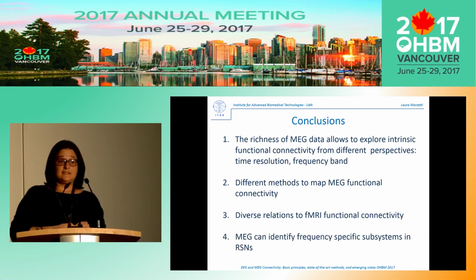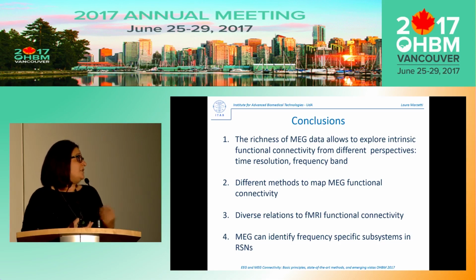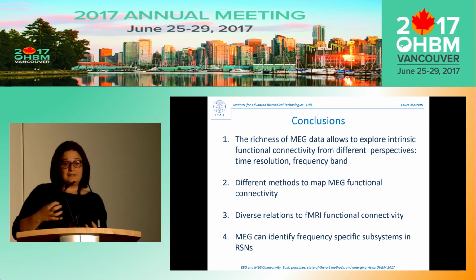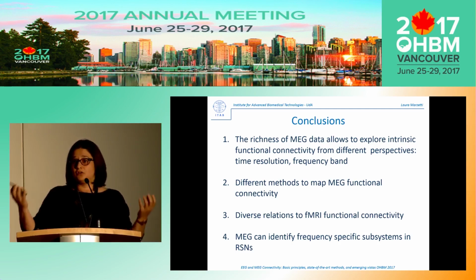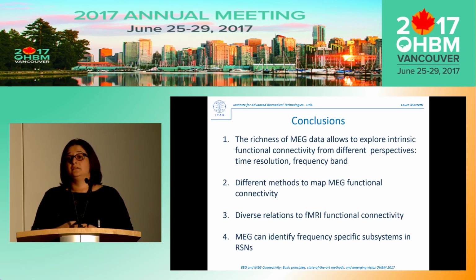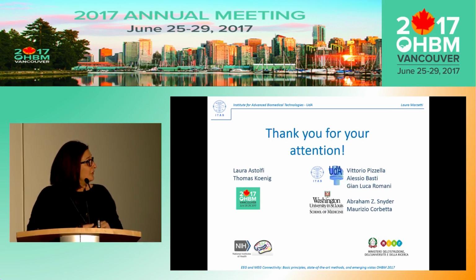And finally, my understanding of all this story, as seen from MEG, is that MEG is able to identify some frequency-specific systems which possibly are part of resting state networks. So they identify subsystems which belong to the larger concept of resting state networks as it has been brought about by the fMRI community.